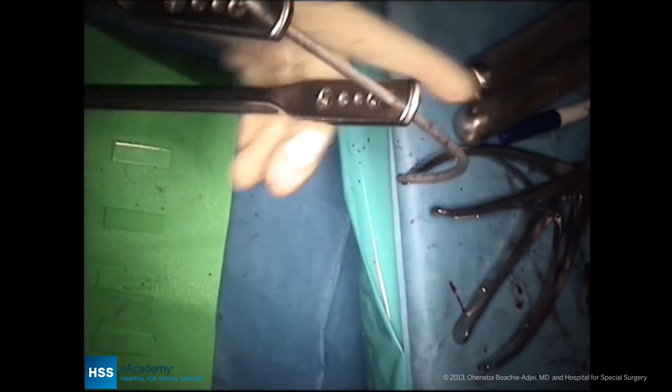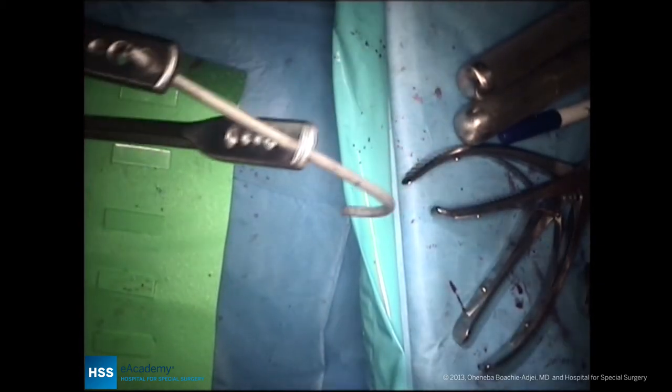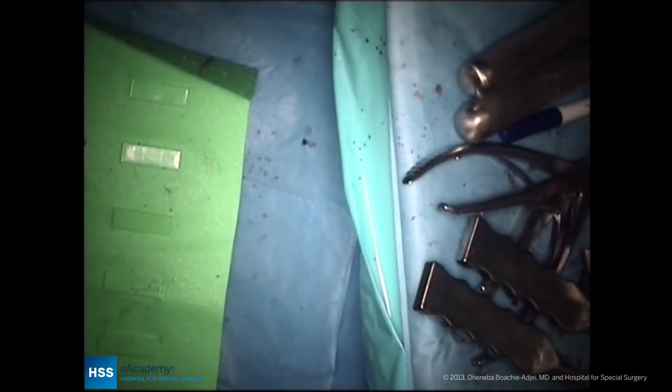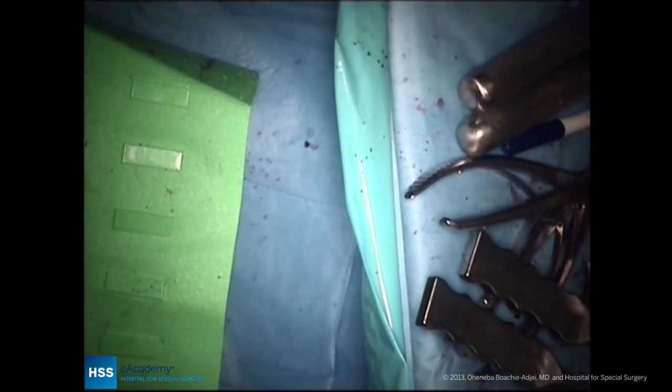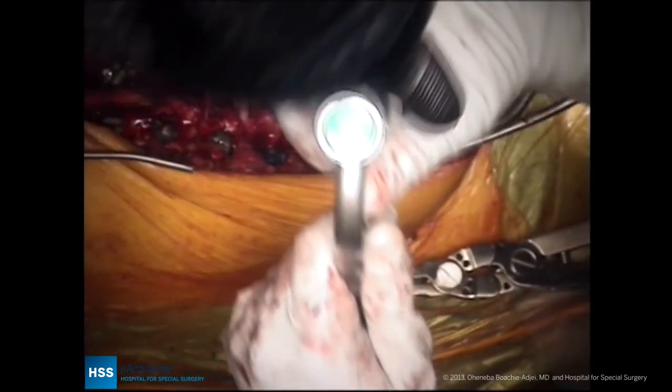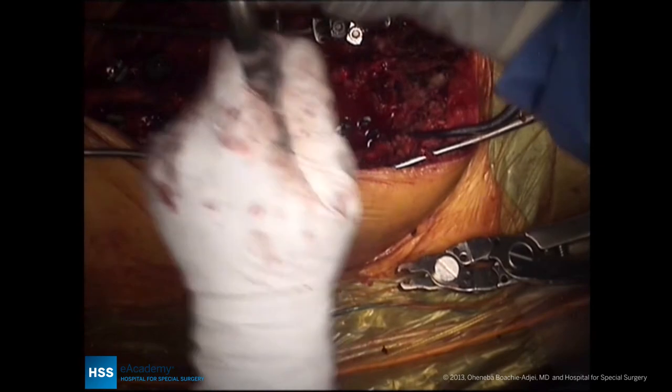A little thoracolumbar kyphosis is placed at the end of the rod to prevent junctional deformity, with the rod being too lordotic in the thoracolumbar spine. We are aiming for a 50 to 60 degree lordosis to match her pelvic incidence.